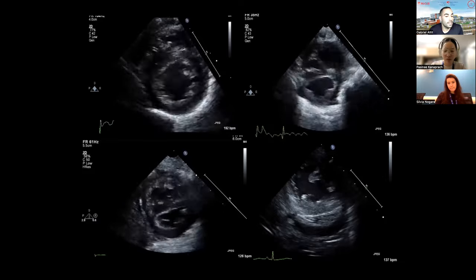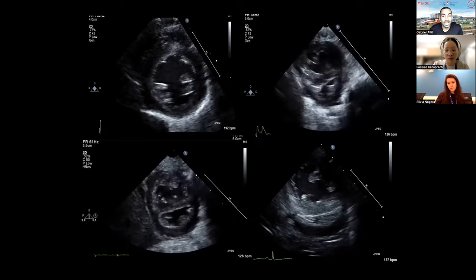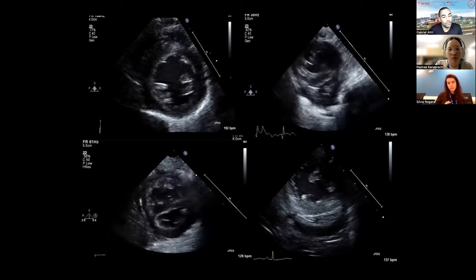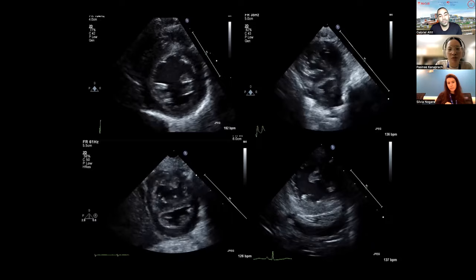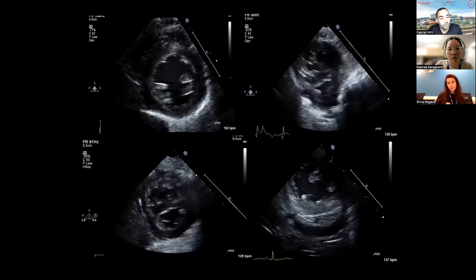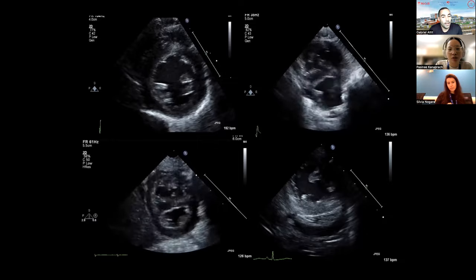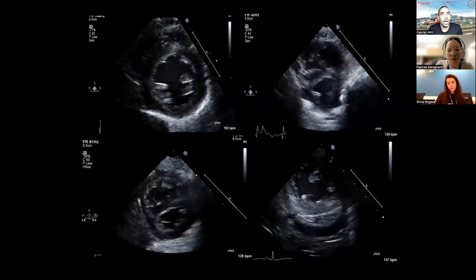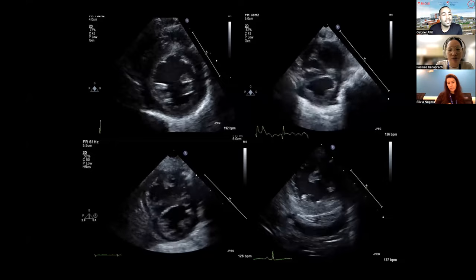If you're assessing in diastole, it informs you on end-diastolic pressure. So if you get septal flattening at the peak of diastole, when the ventricles are filled, it tells you that the pressure in diastole in the RV is as high as the pressure in diastole in the LV, which could be because the RV diastolic pressures are high. And we see that in situations where you have, for example, diastolic volume overload. Exactly. So typically in patients that have, for example, vein of Galen or hepatic hemangiomas, ASD, exactly.